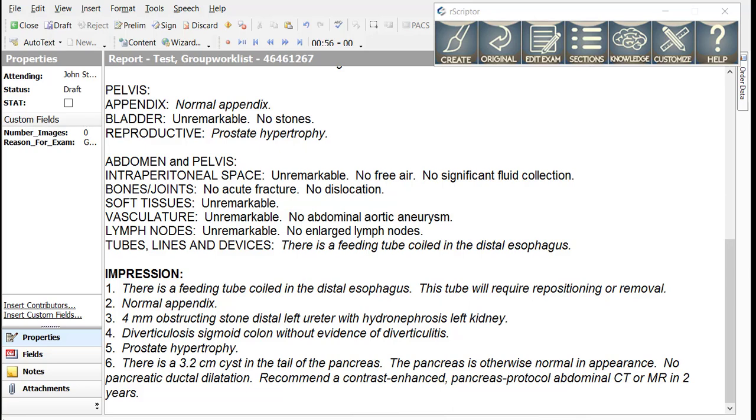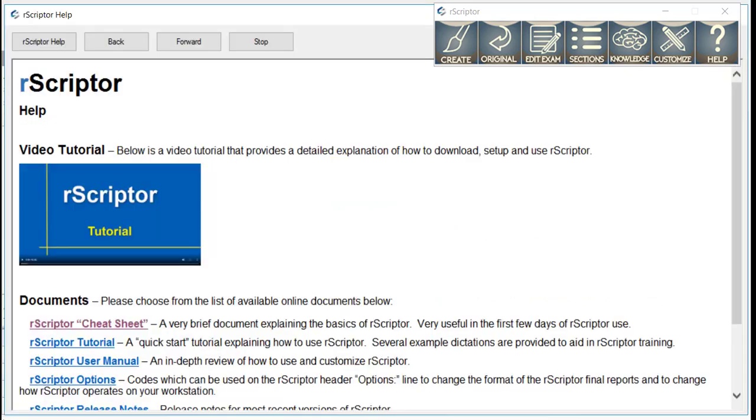During the first few days of dictating using the keywords and modifiers, you may find the R-Scripter cheat sheet to be helpful. It can be found by pushing the Help button on the main R-Scripter interface and then selecting the Cheat Sheet link.